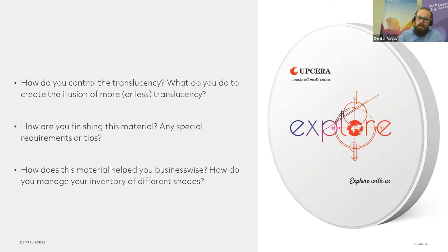No, look, in the end, the biggest blame is always the weakness of the material, but there's obviously more to it. Like you said, you also have to change your way of thinking when you do your designs, combining optimal strength with minimum stock. Yeah, I think it's a really good solution for the majority of the cases.